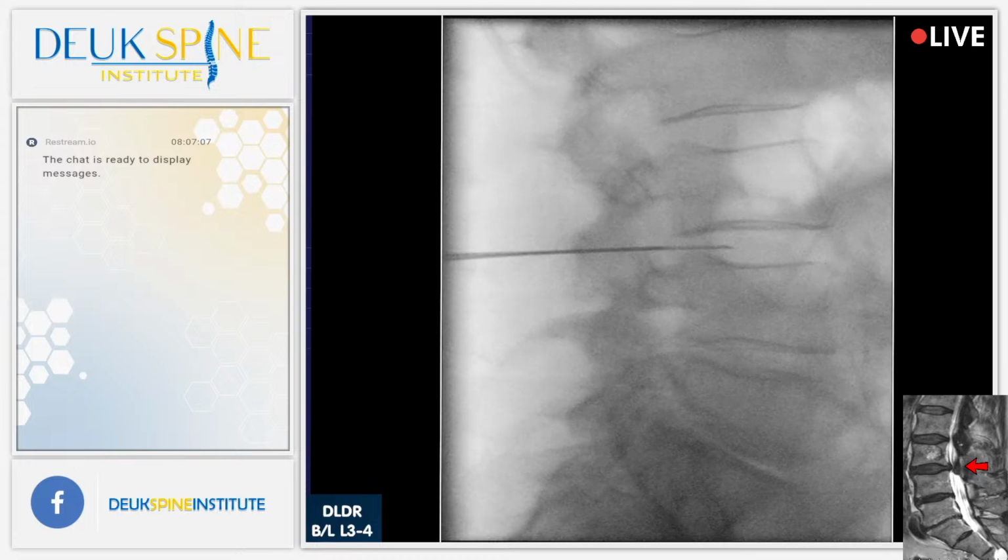I just touched it. Show us the second needle, the one I'm placing now, Jordan. The other thing, Jordan's going to show you the tip. There it is. That's where I just felt the herniation. That's where it's sticking out to. Now, Jordan, show us the back of the L3 vertebral body. You guys see how there's a double shadow there? One there and one there. Yeah, there's two lines. They go up. You see them go up?